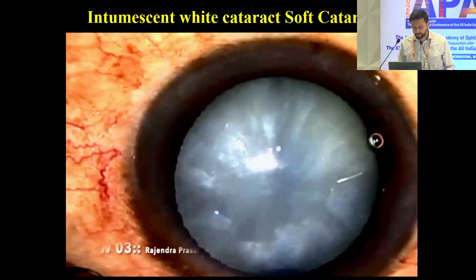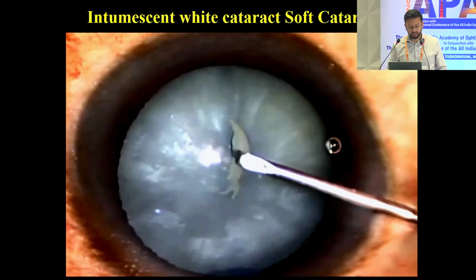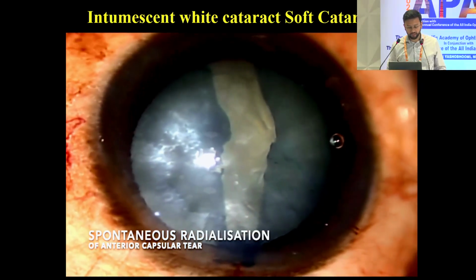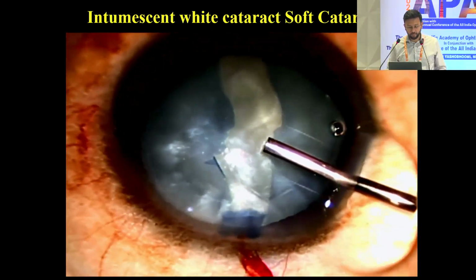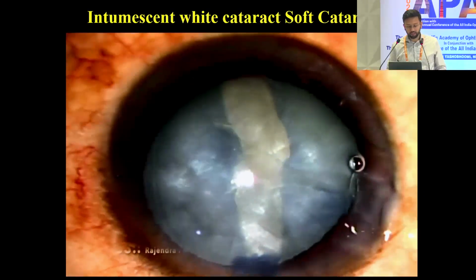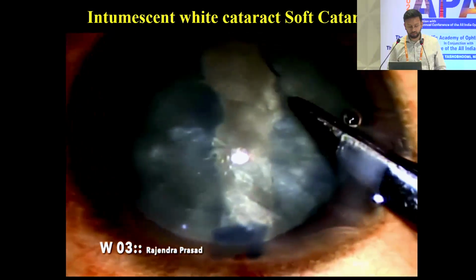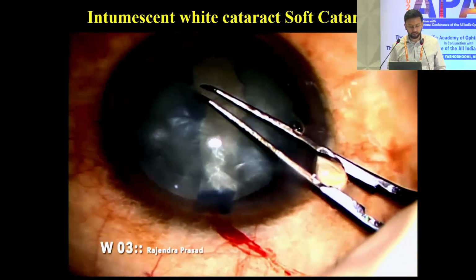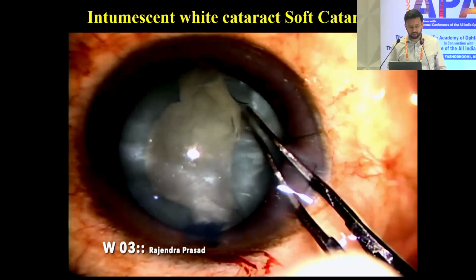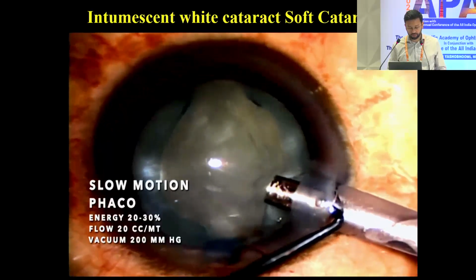So this is another case of an intumescent white cataract, where the Argentinian flag sign is a known complication. There is a sudden radial extension of the initial prick on the capsule. In such cases, again, we do not need to panic. We can attempt to create a round capsulorhexis from the tear, so that during the rest of the steps of cataract surgery, there is less chance of extension of the tear post-equatorially into the posterior capsule.